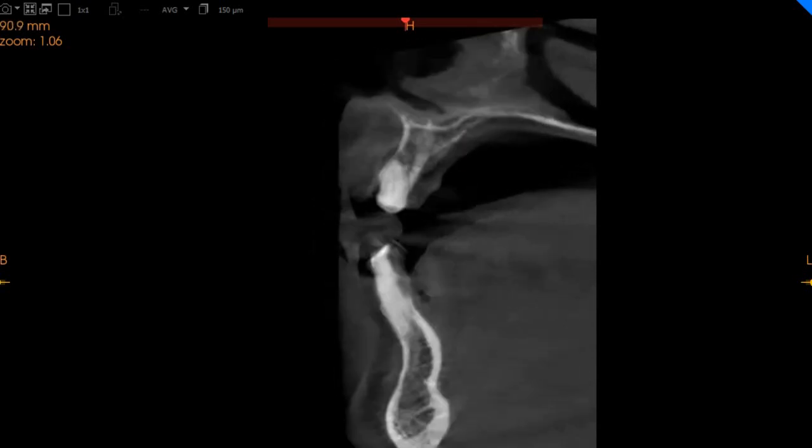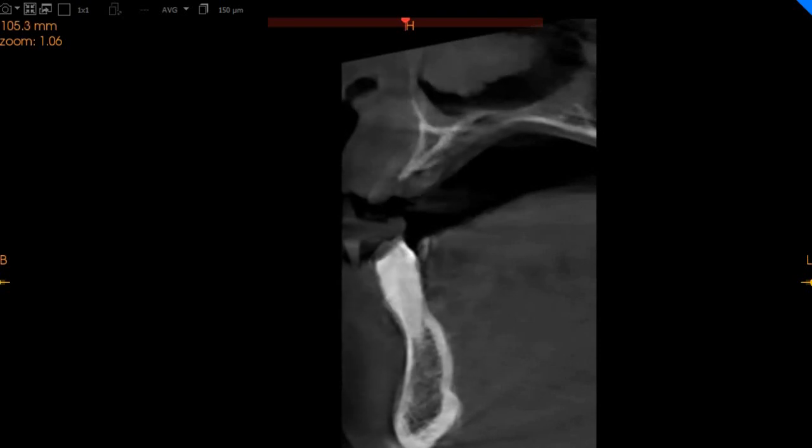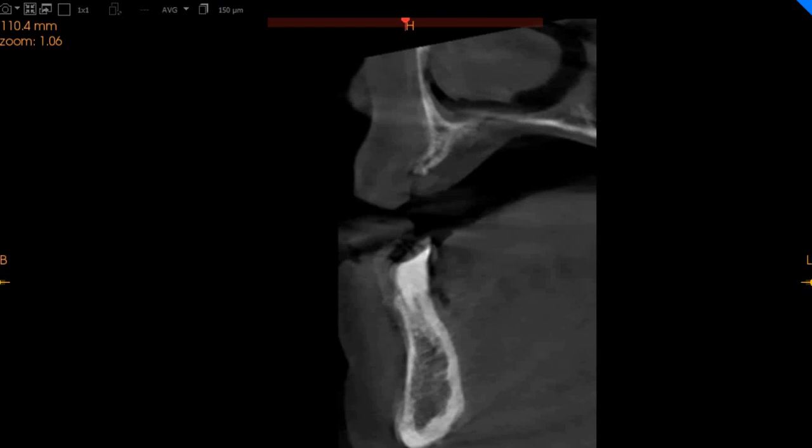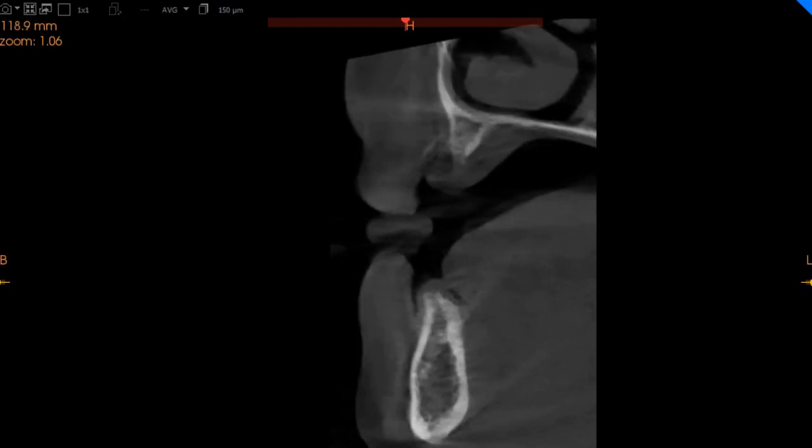Moving to the upper left hand side, this central incisor is probably grade 2 mobile. We don't have any good bone support. In the lateral incisor region, we've got a thin ridge, knife edge. The canine, we've got a thin knife edge ridge. On the posterior area, where the premolars are, again, we've got very resorbed ridge. So the upper left hand quadrant does not have sufficient bone, so bone augmentation is advised prior to implant placement.